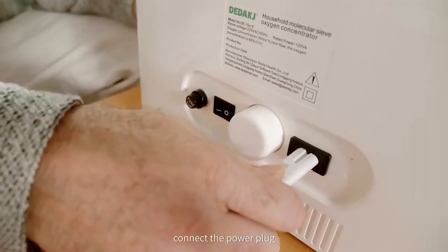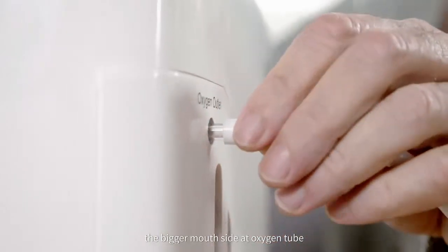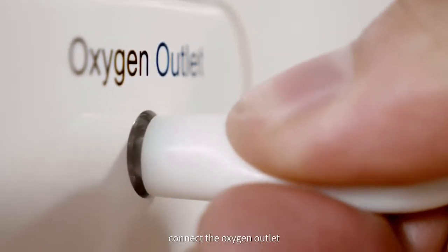Check whether the air filter is installed in place. Connect the power plug. Install the oxygen suction tube — the bigger mouth side of the oxygen tube connects to the oxygen outlet.